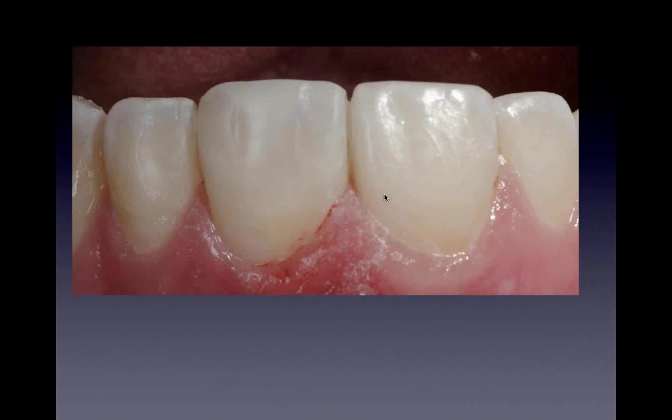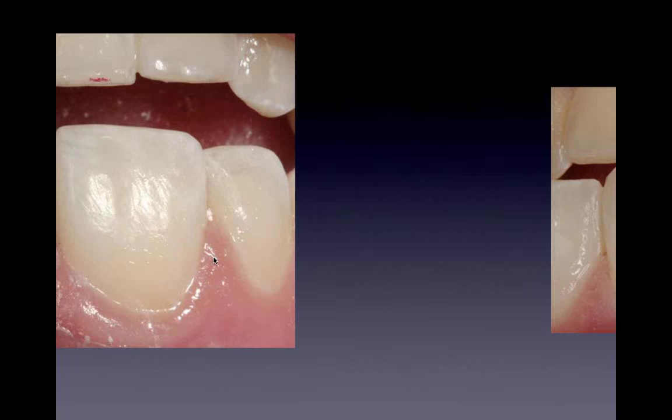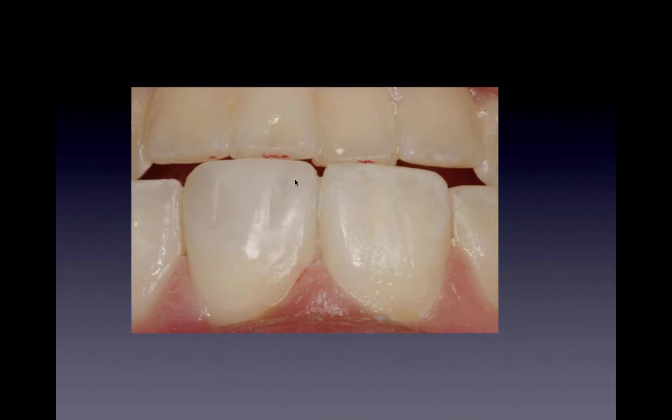interproximal separators. So we see our final restoration here. You can see the crack lines and the craze lines here as well from the accident. We basically polished it up, and now we're ready to shine it up. And you can see the different colors that are matching here. I don't think this is an ideal situation, but again, this is our temporary, so to speak. It's our provisional. And here's our bonding technique. You see here the craze lines. So for a quick fix, I think he was very happy. If I wanted to do a final and get a little crazy, I would definitely use some more colors in between here if this was going to be my final restoration.